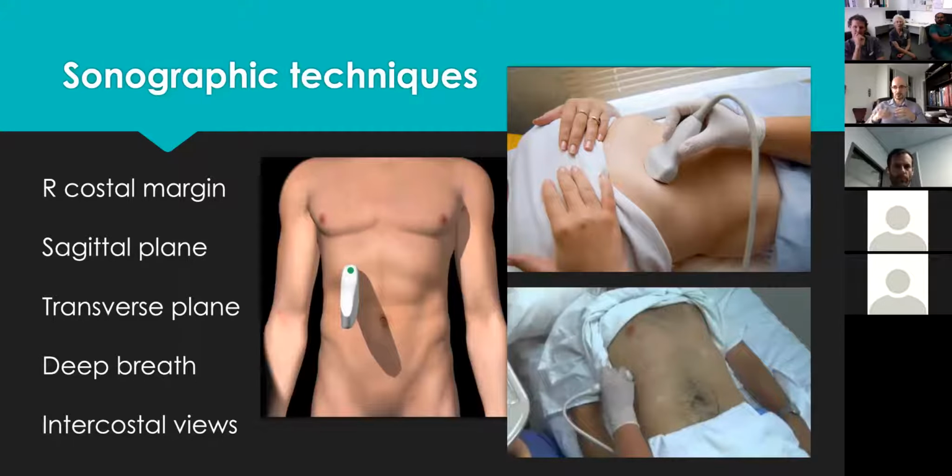The second position is something like erect or sitting, or I've seen the radiologists at Nepean radiology department doing the kneeling position on the elbows and the knees, so that the patient is actually prone, but they can put the probe under the patient. And I'll explain again why it's important. It may or may not be doable in ICU type patients, but if some of them can do that, then that would be ideal.